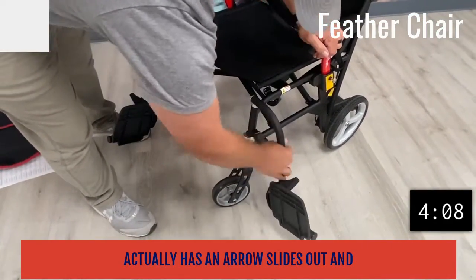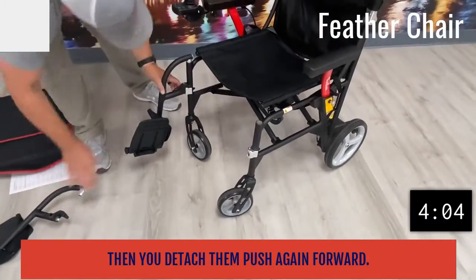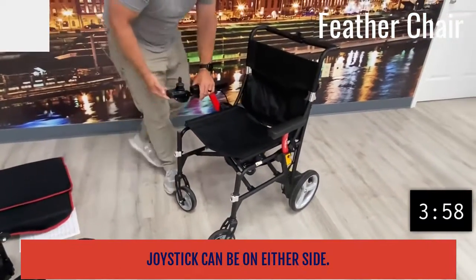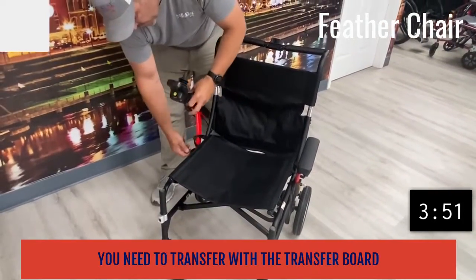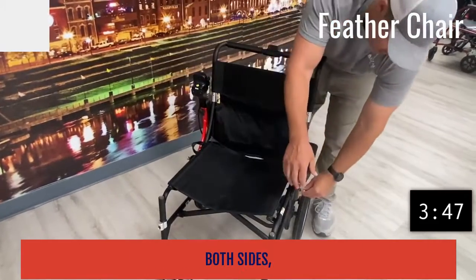Press the arrow, it slides out, and then you detach them. Push again forward and they fold down — easy to take on and off. Your joystick can be on either side; you can put it on the right or left. One thing I like about this is if you need to transfer with a transfer board, you have the ability to do that on both sides.